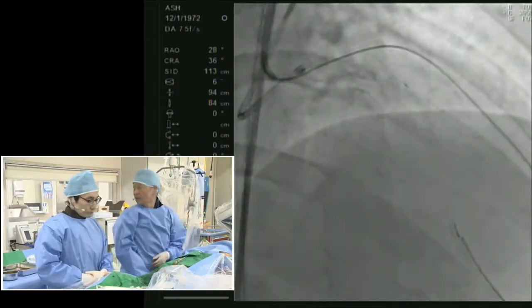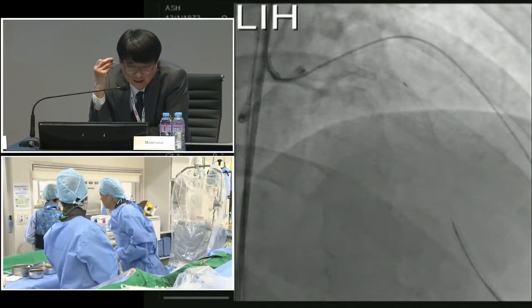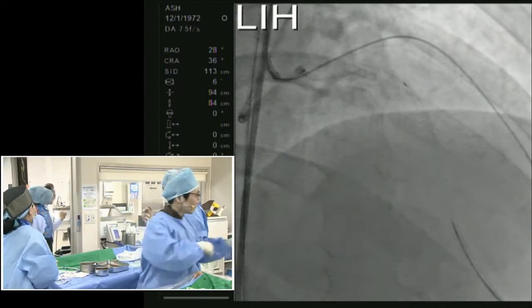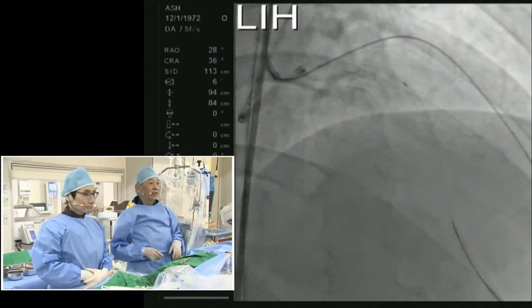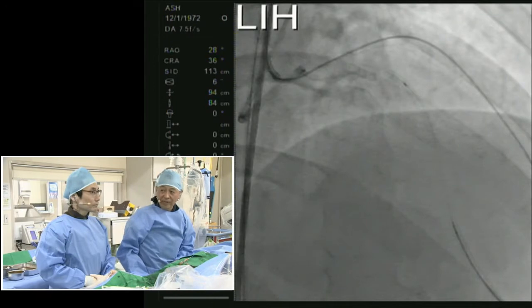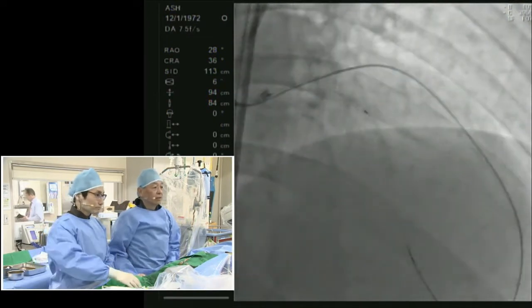I think most CTO guys hate that kind of DCB. Okay. 3.0 DCB is not available. If so, stenting. Okay, all right. I discussed with Professor Jansujan. Based on insurance reimbursement regulation, stent is better. Dr. Igarashi, please don't forget to treat the LAD region.